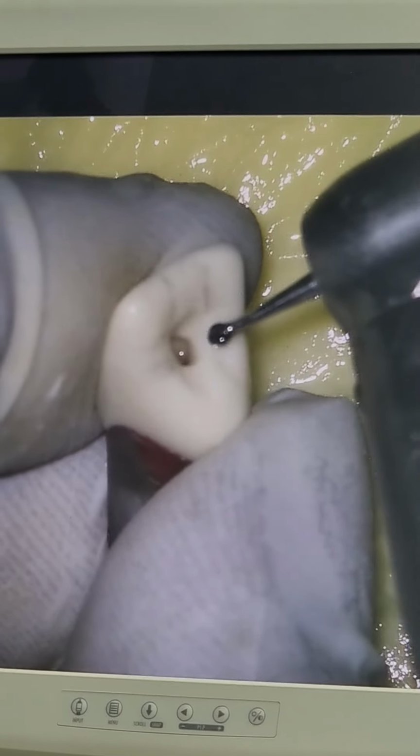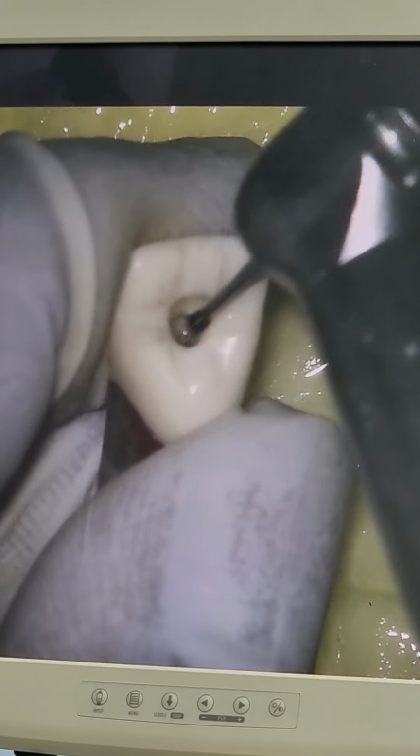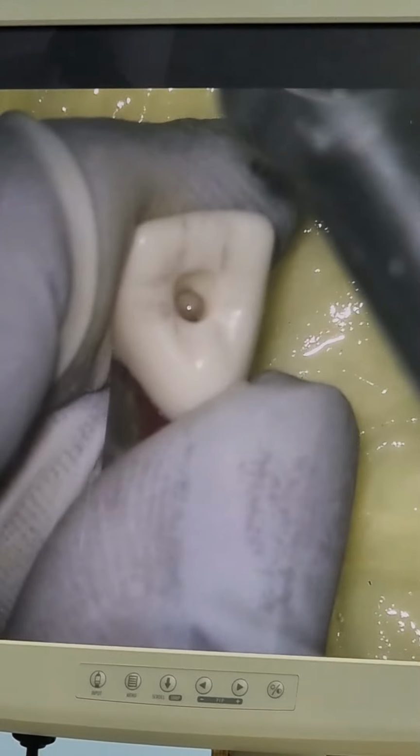If you do any more angulation than required, you will cut more tooth structure from that wall, be it a buccal, mesial, distal or lingual wall. Any extra removal of the internal wall of the access cavity is also an error of access cavity preparation, and the name of that error is gouging.